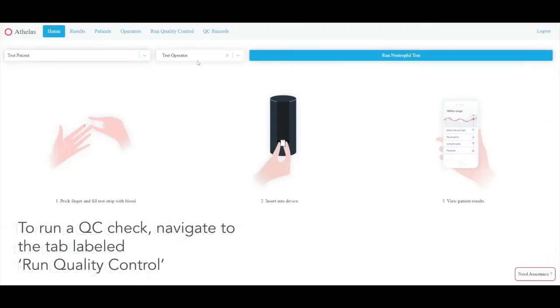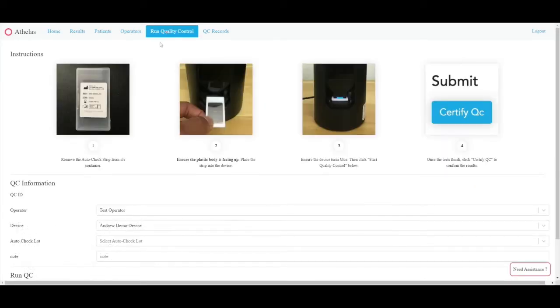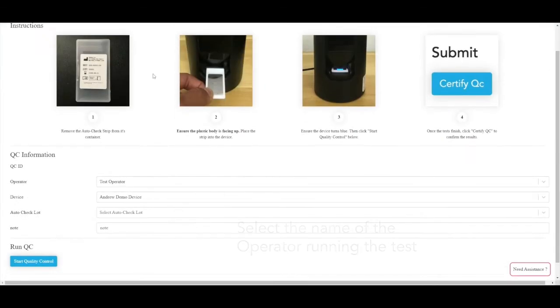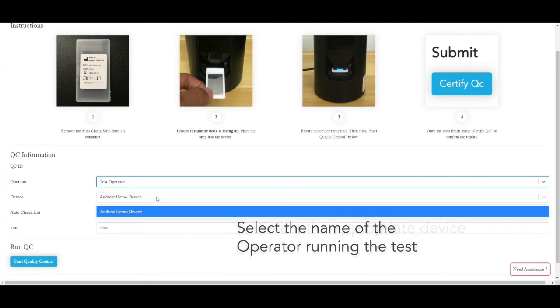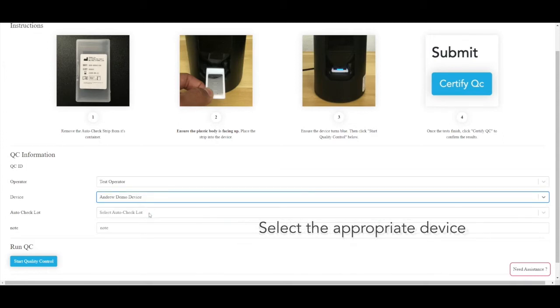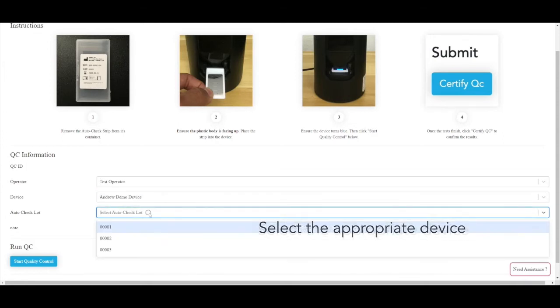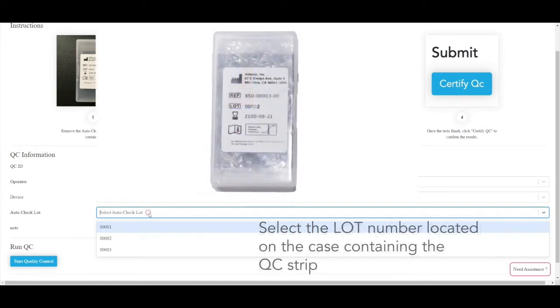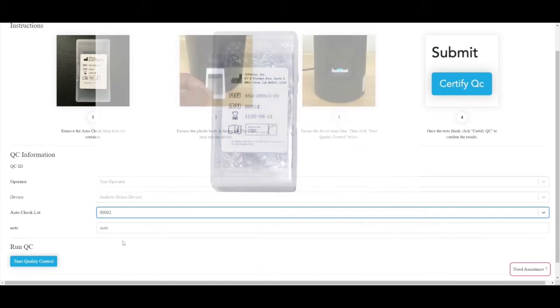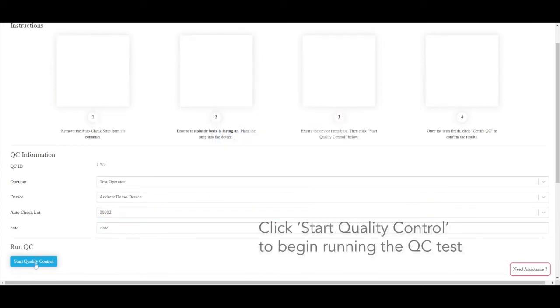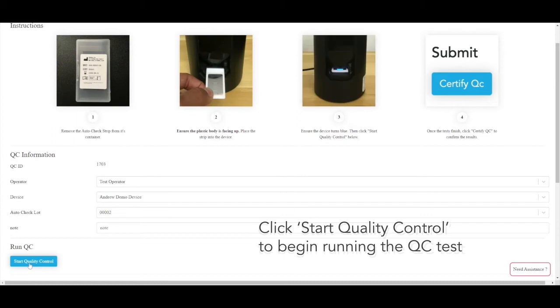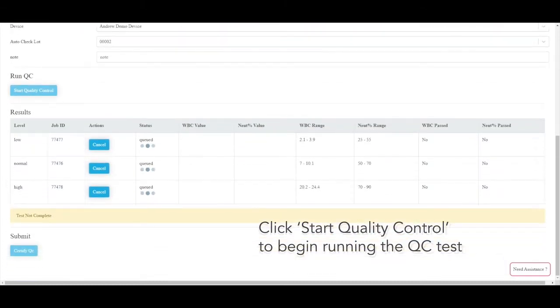To run a QC check, navigate to the tab labeled Run Quality Control. Select the name of the operator running the test. Select the appropriate device. Select the lot number located on the case containing the quality control strip. Click Start Quality Control to begin running the quality control test.